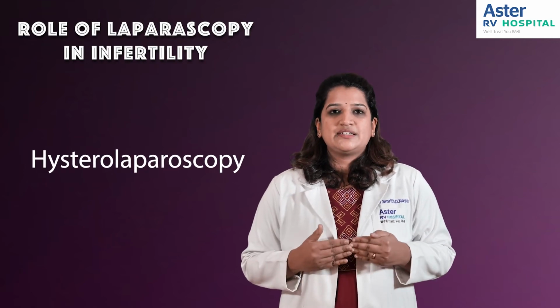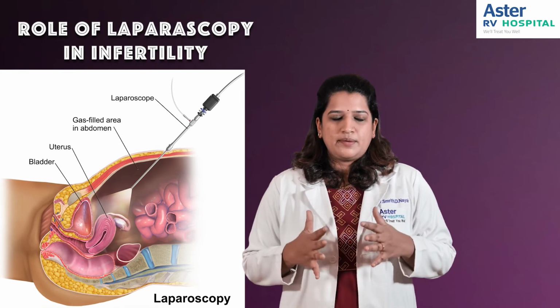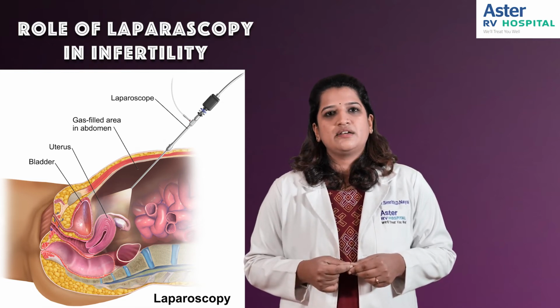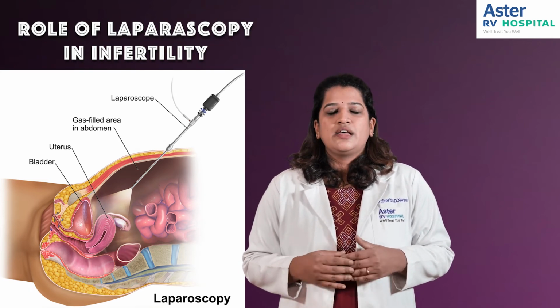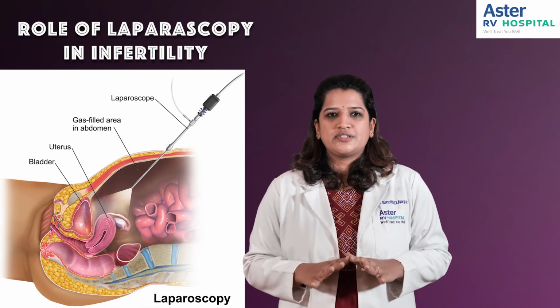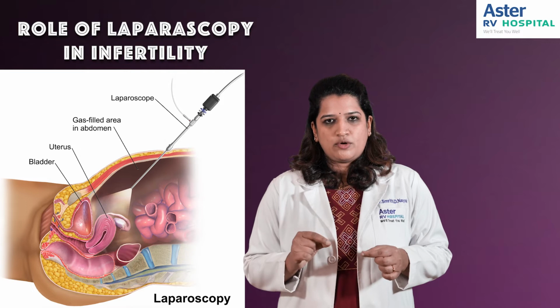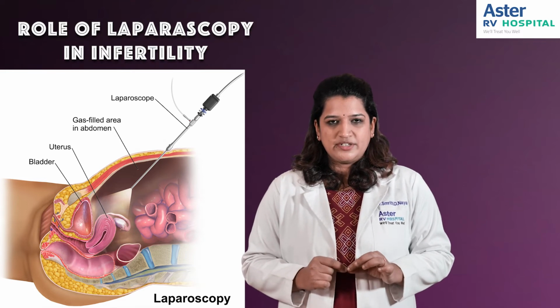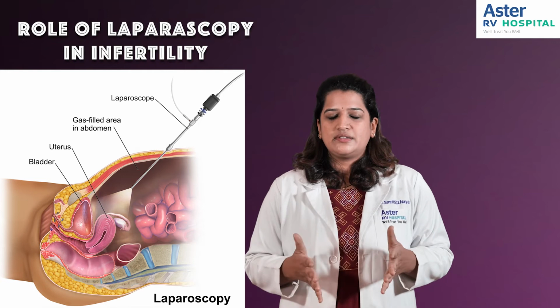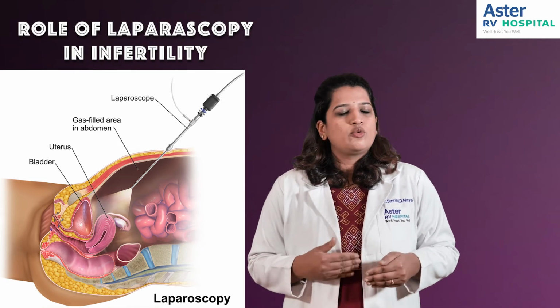Moving on to the procedure of hysterolaparoscopy, as I already mentioned, it is a daycare procedure and most of the patients can get discharged on the same day. The pain is quite minimal as it is a keyhole surgery, and the post-op recovery time as well as the post-operative pain is minimized. In this procedure, the anesthesia given is usually general anesthesia where the patient is completely sedated, and after the anesthesia is given, the surgeon places a needle inside of the abdominal wall to inflate the abdomen with gas. After this, a camera is inserted into the abdominal cavity to scan the abdominal structures as well as the pelvic structures.